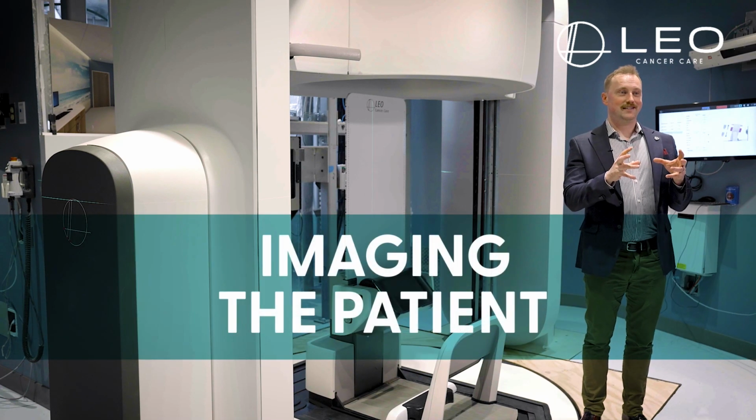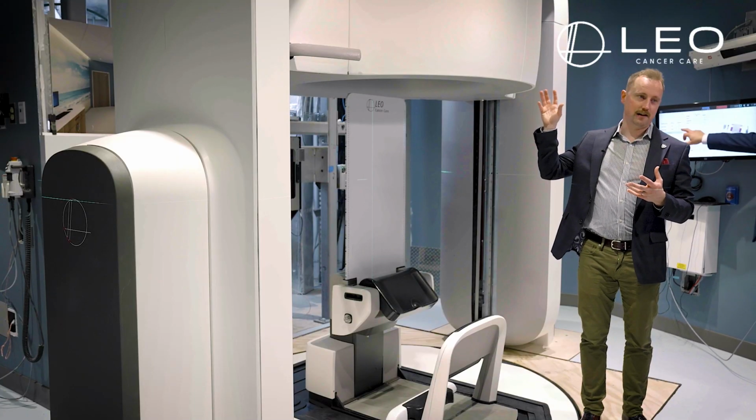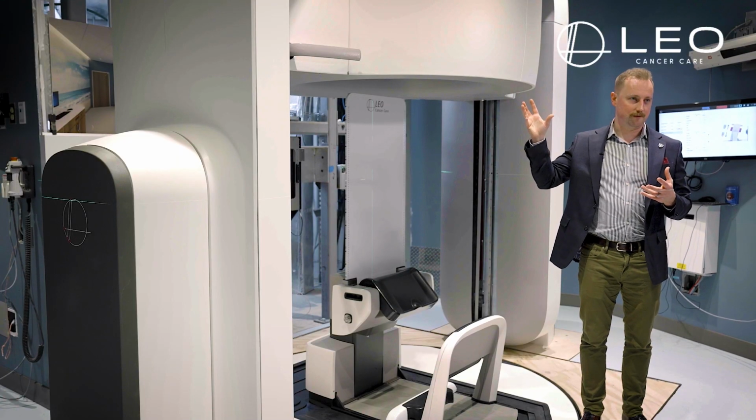But patient positioning is only one piece of the puzzle. To be able to make radiation therapy work in the upright orientation, we have to be able to image the patient upright as well. And this is where the integrated CT functionality comes in.